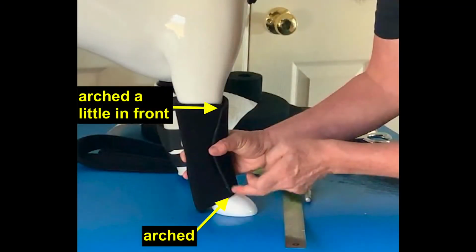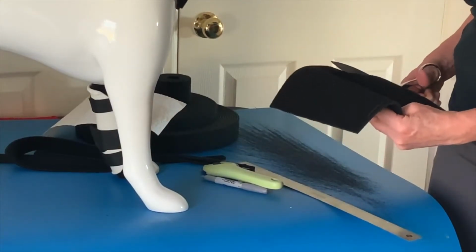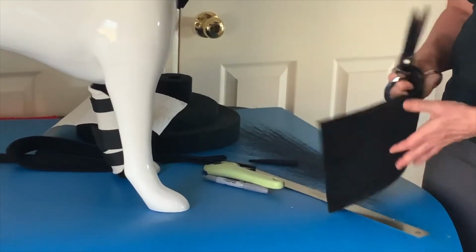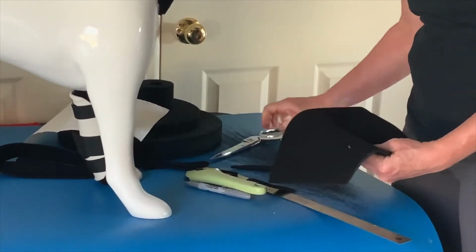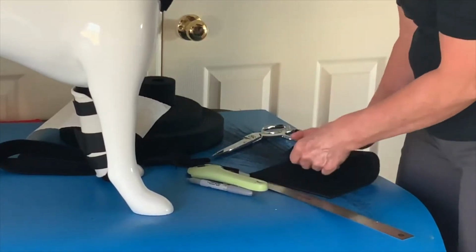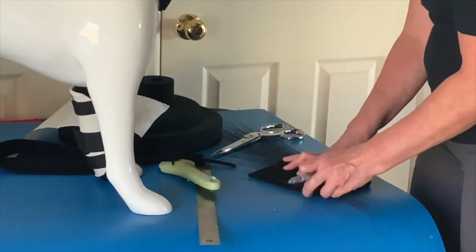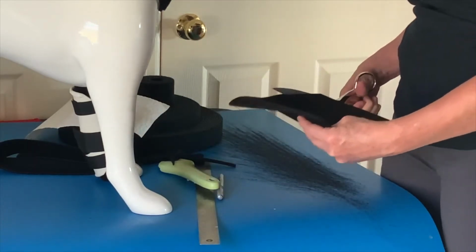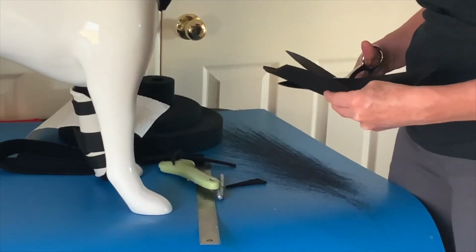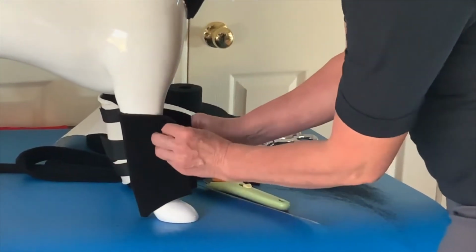Then cut out your arches to allow room for the digits and allow the elbow to flex. Cut out one side first, then fold the material in half and trace your arches on the other side. This will ensure that your arches are symmetrical. Then cut those out as well. Check it one final time before adding your closure and your straps.